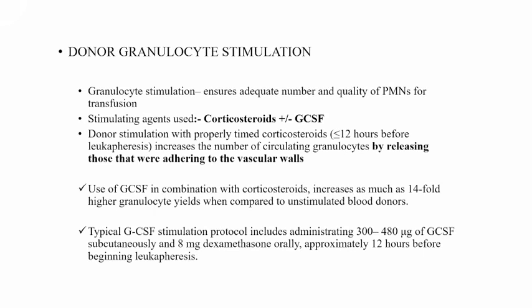Typical GCSF stimulation protocol includes administering 300 to 480 microgram of GCSF subcutaneously and 8 milligram of dexamethasone orally approximately 12 hours before beginning the procedure.